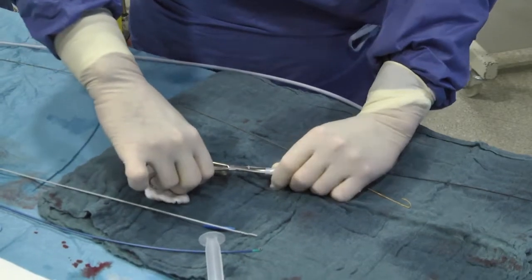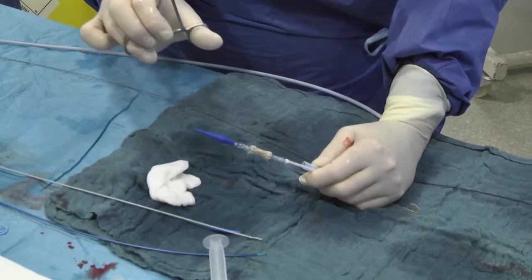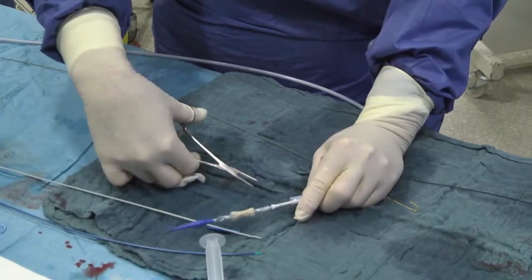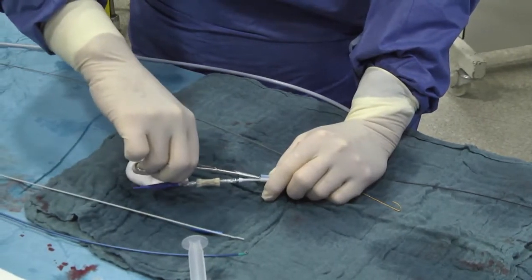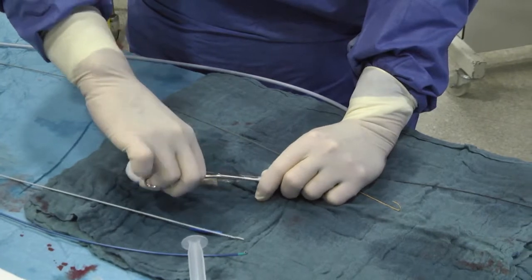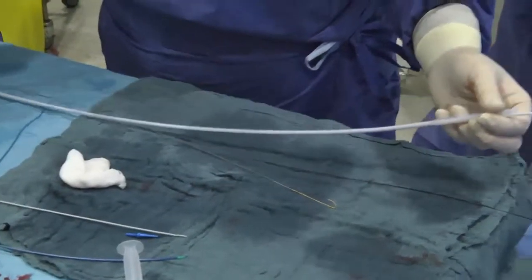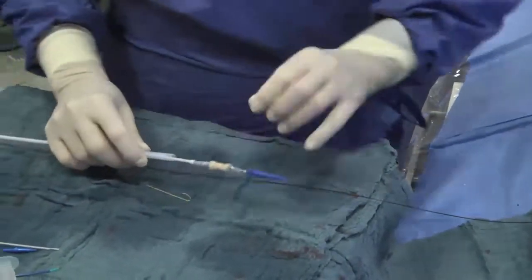Tell us, what are you doing now with the scissors? Are you cutting or just expanding? Just expanding. It's not scissors, it's a Kocher. Don't use too strong ones. I'm just stretching this a little bit. You don't really need it, but it makes life a little bit more pleasant.